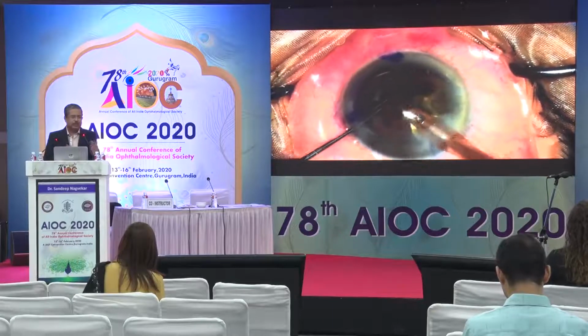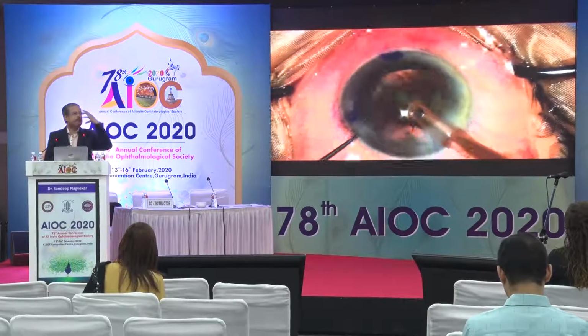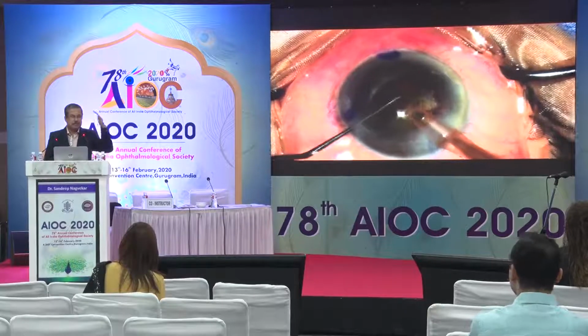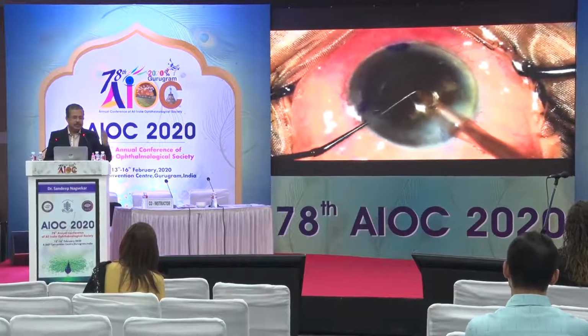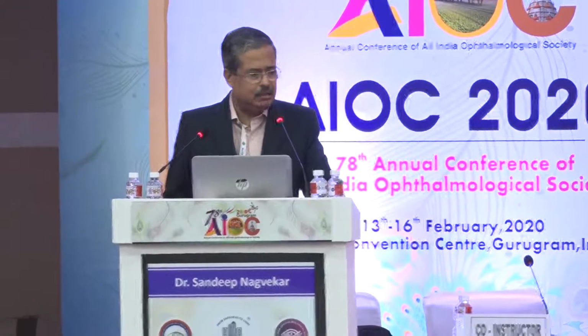I would compare it to the seal in the circus who's balancing the ball on the tip, and you think that he's balancing it on the tip of his nose, but all the time he's moving the nose to keep that tip just bobbing up and down. This will ensure that the nucleus remains over there without flying off to the endothelium, as sometimes it happens, with potential damage over there.